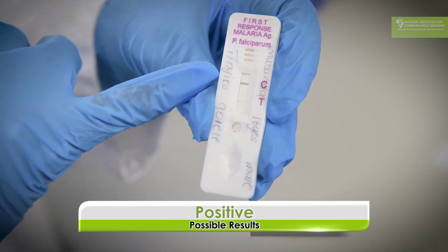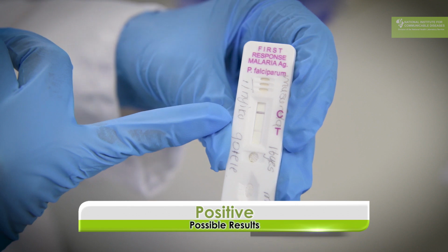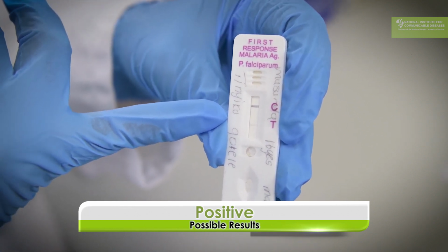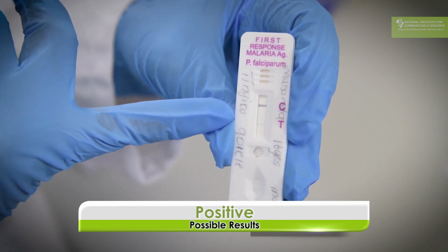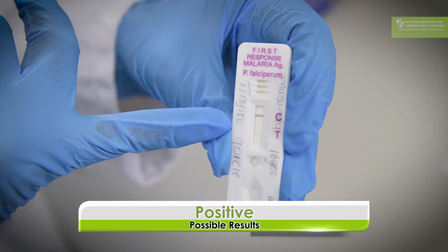Now this is also a positive result. You can see a very clear control line. However, the test line is very faint. But even if you get a faint test line, you have to call it positive because anything that comes along at the test line indicates that there's a malaria infection, so you have to call this a positive test.